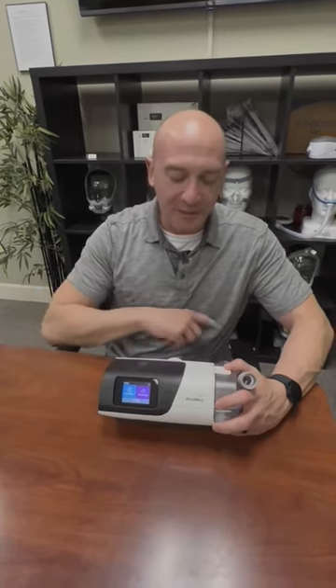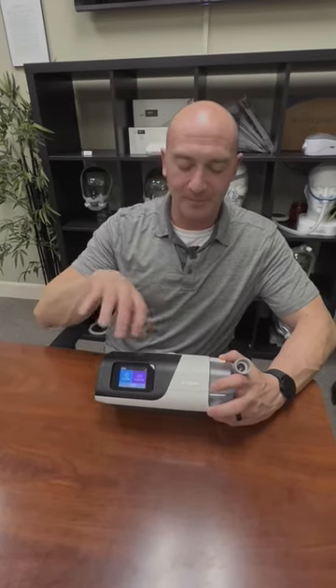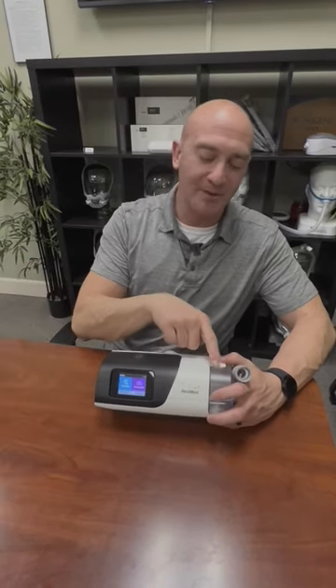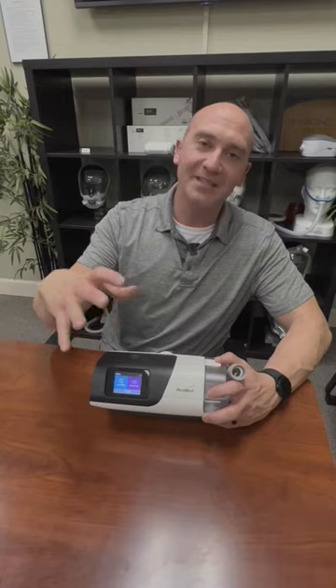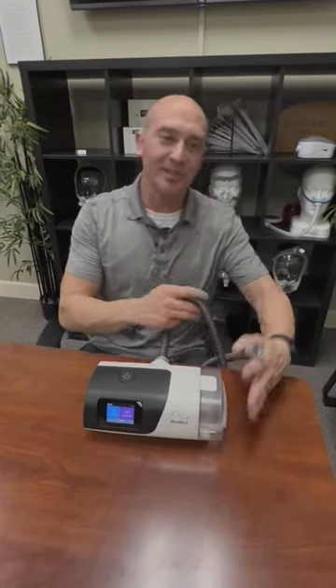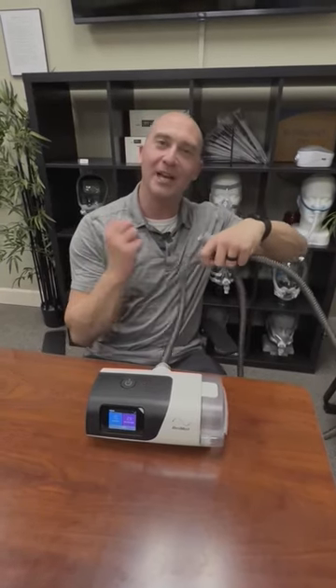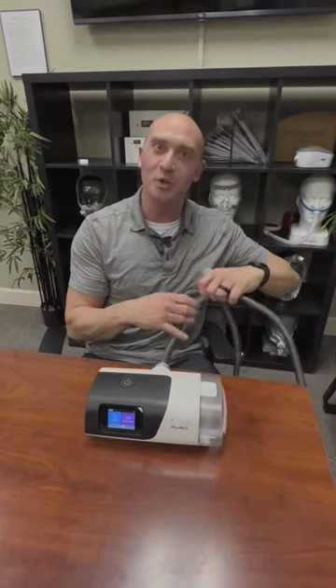A couple of quick things. Water in the tubing is just because your humidifier can't quite keep up with how cool your room temperature is. What's happening is you're coming from a warm, humid source. As air cools, it drops its water. So you get water droplets in here and it usually will sit at the lowest part of your tube and will kind of gurgle and clunk when you're breathing in and out.